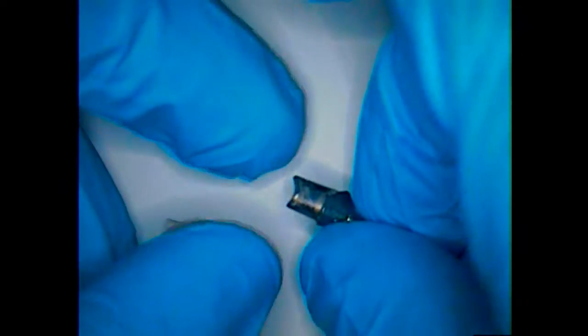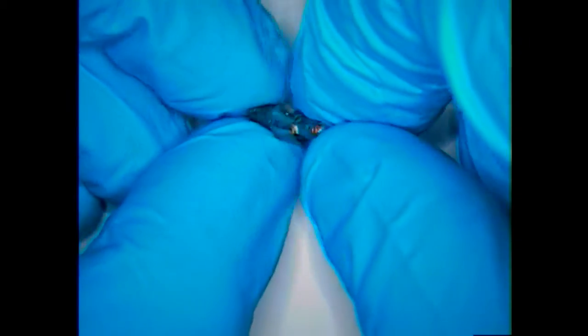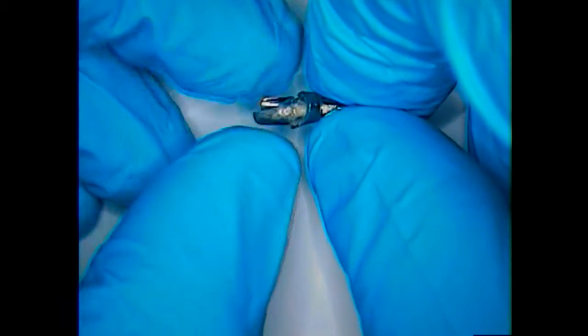I'm going to go ahead and open it up and identify and confirm the identification of the implant system. Over the phone and via email, the patient was able to give me the information from the dentist that placed the implants. This is a Certain abutment — that's the name of the abutment — an angled abutment from Biomed 3i. Within the abutment is the fractured screw; it's a gold tight screw.